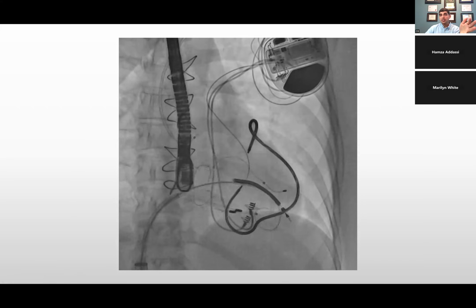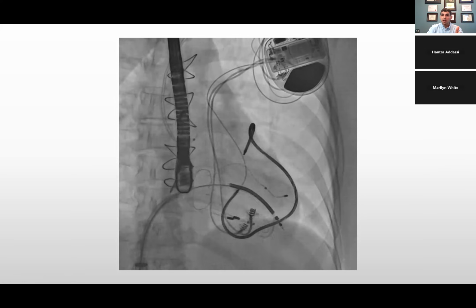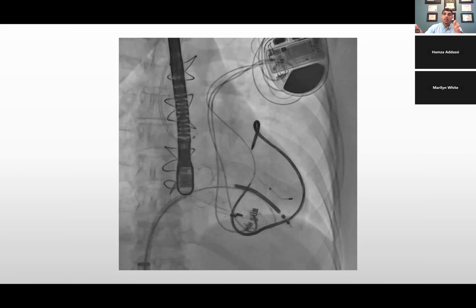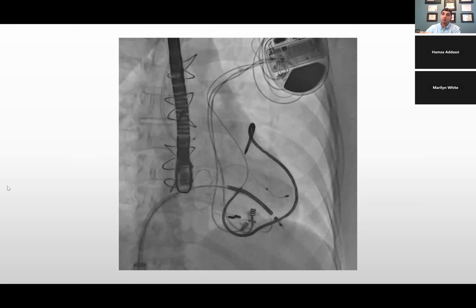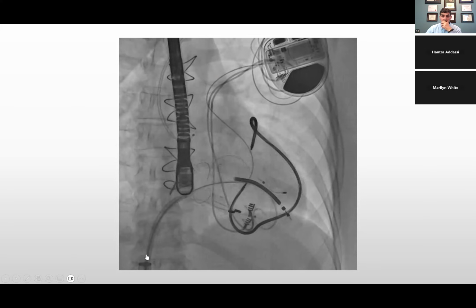So one idea sometimes is, well, if I do surgery on the patient when she's 45, she's going to need another valve when she's 55. So why don't I give her a transcatheter valve now and have her undergo surgery when she's 55 and reset the clock where they could put a new valve? And so that was one of the cases here.